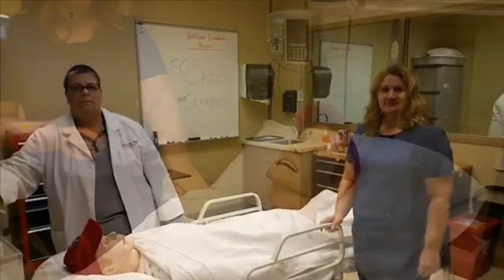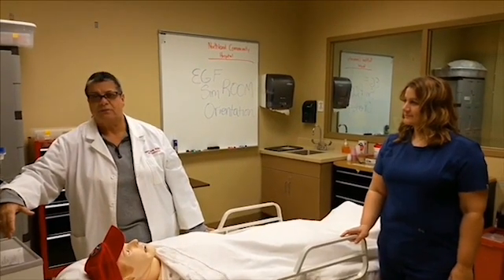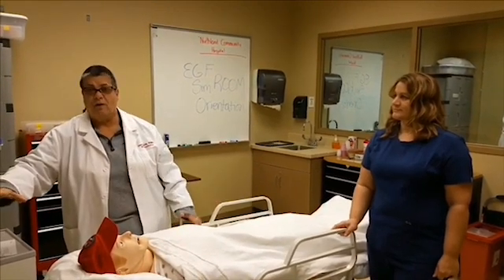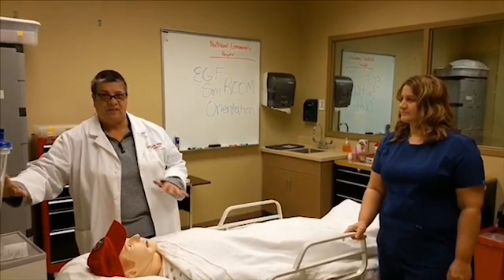You're welcome. Welcome to Northland Community Hospital, East Grand Forks Simulation Room. You've previously watched a video about the Simulation Man. This particular video, How Do I, is about the equipment and things in the room.